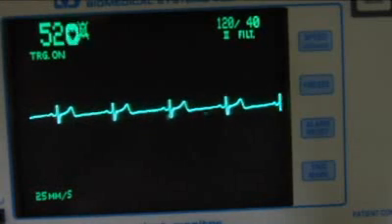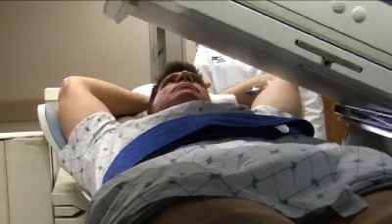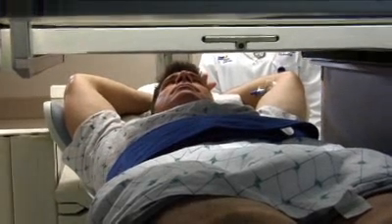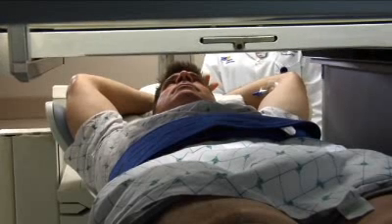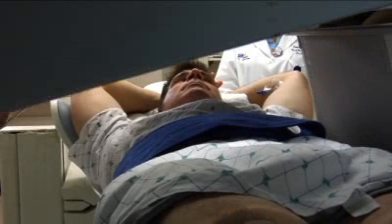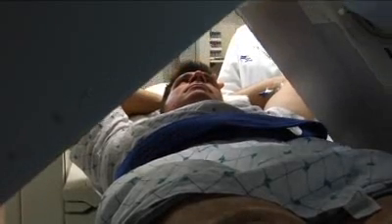Next, you will lie on a scanning table and a special camera called a gamma camera will be positioned close to your chest. You will be asked to lie still. The gamma camera takes pictures of your heart. This part of the test takes approximately 20 minutes.